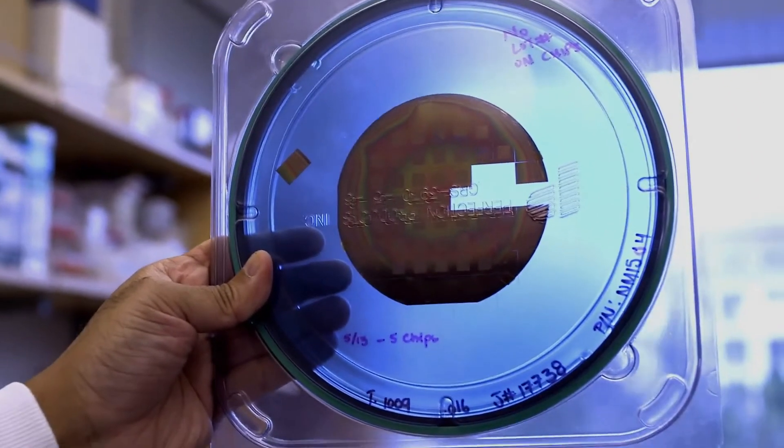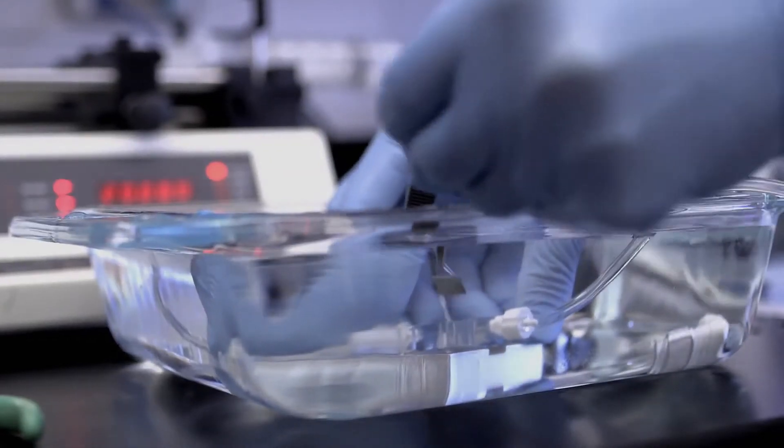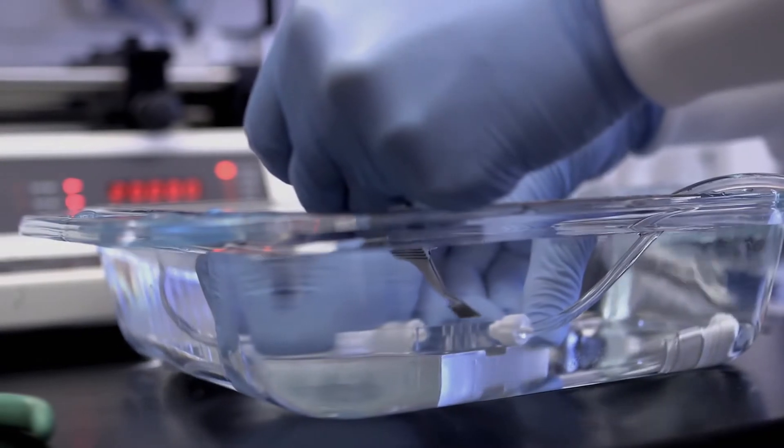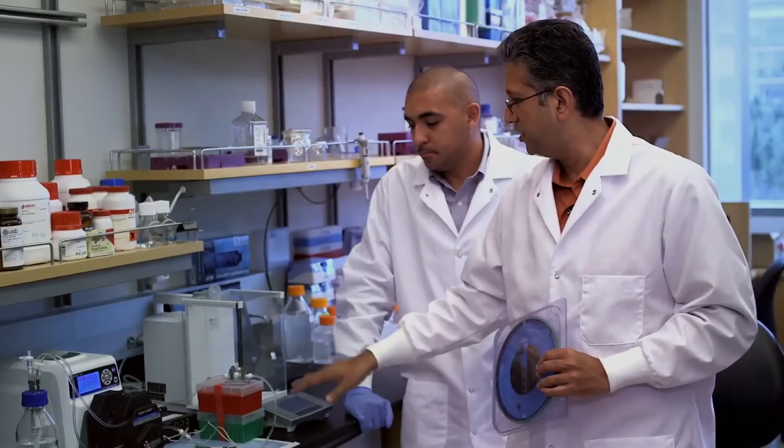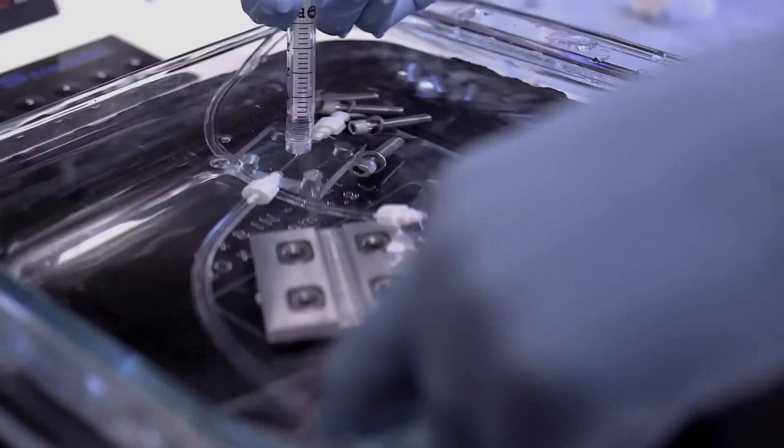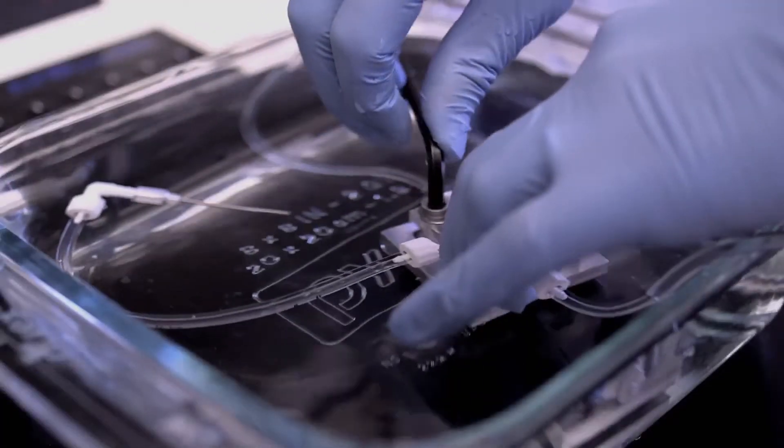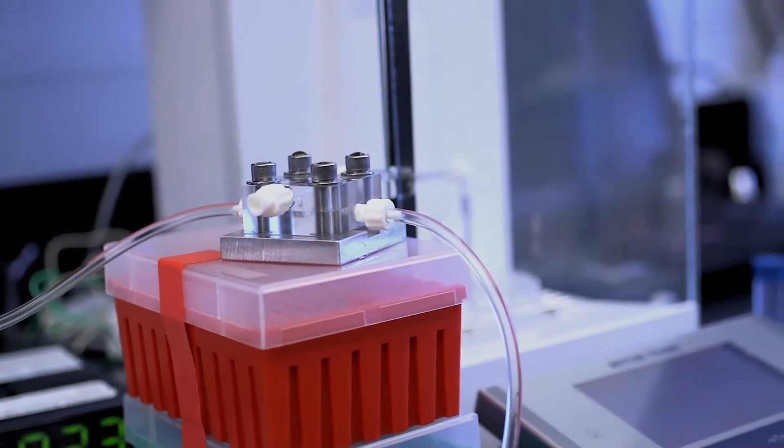So, we take these membranes, cut them into little squares, and test each of the individual membranes for how they perform in terms of filtration. We challenge it with water and very small particles in the water, and we see how much water comes out and what particles come out.